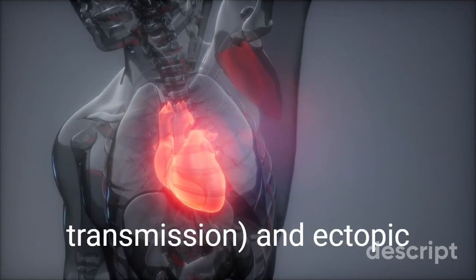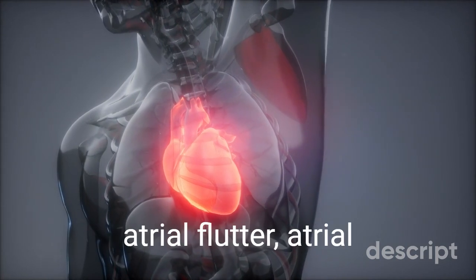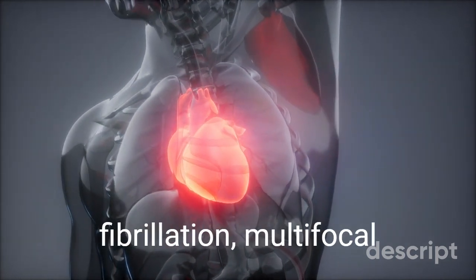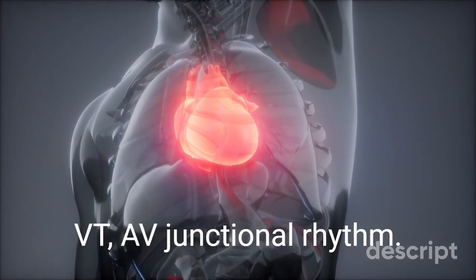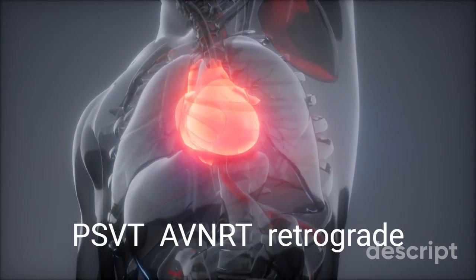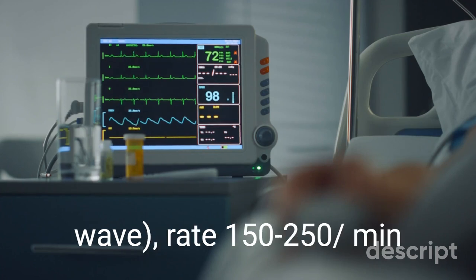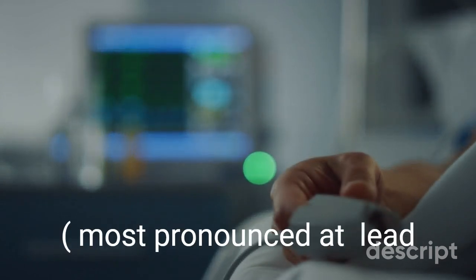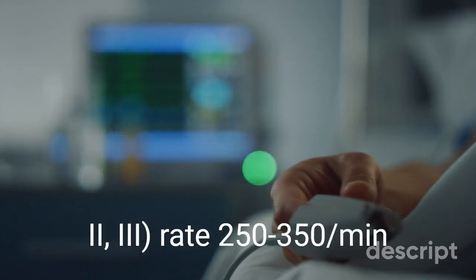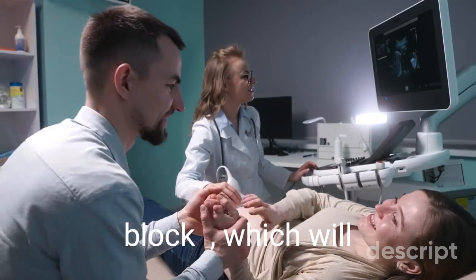3. Reentrant rhythms and ectopic rhythms, such as paroxysmal supraventricular tachycardia, atrial flutter, atrial fibrillation, multifocal atrial tachycardia, ectopic atrial tachycardia, VT, AV junctional rhythm. PSVT, AVNRT: retrograde P-wave, rate 150-250 per min. Atrial flutter: reentrant circuit around the tricuspid valve annulus, flutter wave most pronounced at lead II, III, rate 250-350 per min, most common AV block 2 to 1 block.